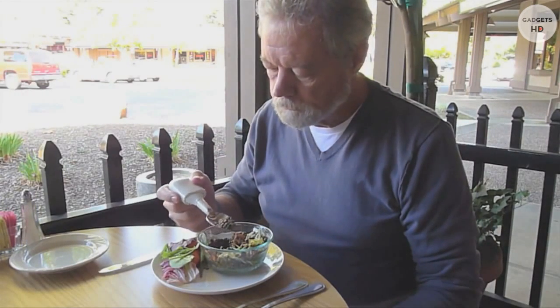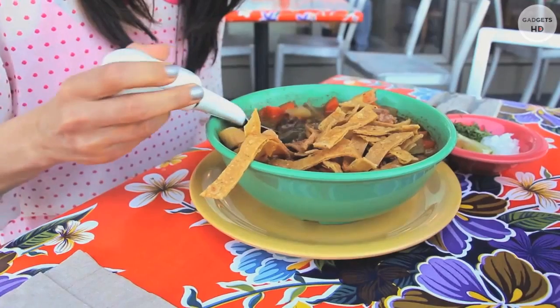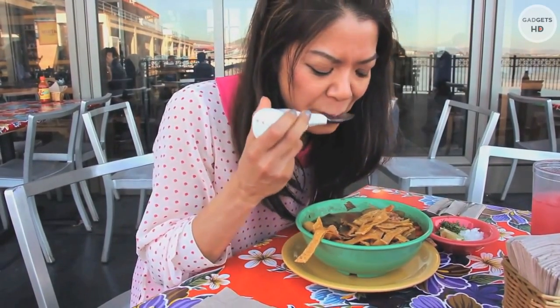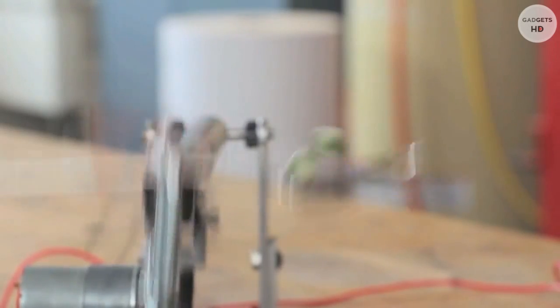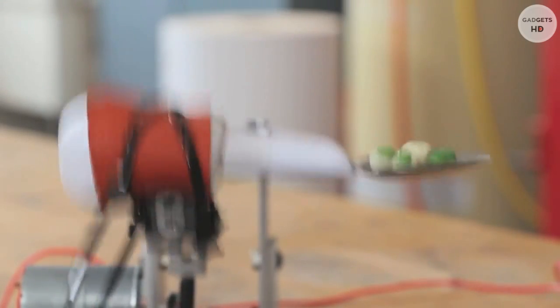We invented the Liftware spoon to cancel hand tremor and take the frustration out of eating. For the first time, we have the technology to actively stabilize a person's tremor in a device so small that it fits in your hand. The spoon works by sensing a person's tremor and intelligently stabilizing itself to make the food's journey from the plate to the mouth much easier.